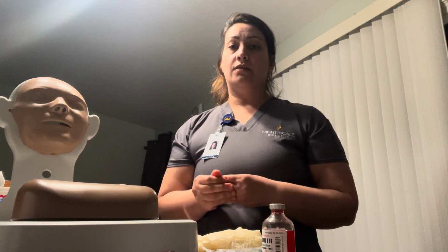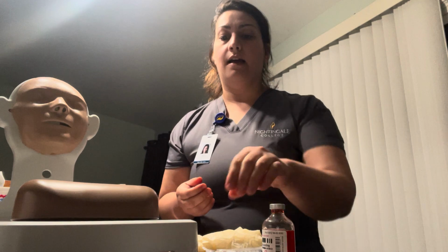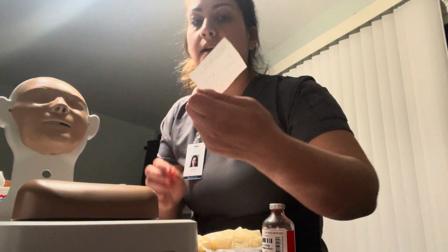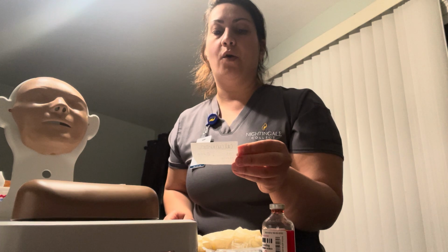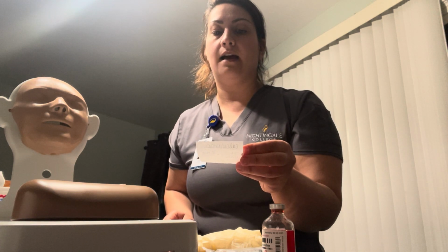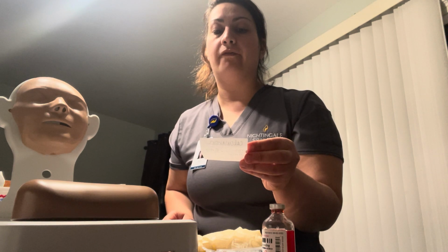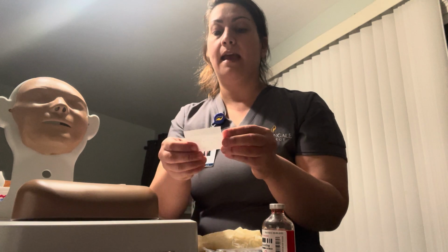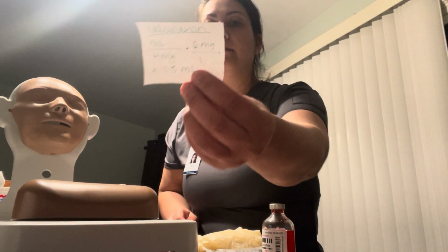All right, next, we're going to calculate the dose. So I have written down the calculations. I'll bring it up. There's nothing in the back. So the calculation is 1 milliliter over 4 milligrams times 6 milligrams over 1, and that is going to equal 1.5 mL.